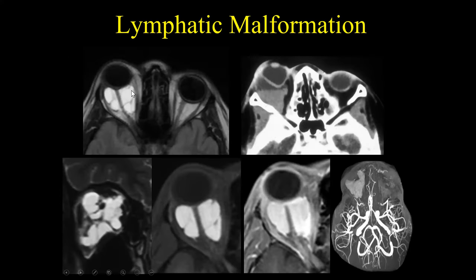Another cause of proptosis is lymphatic malformation. Here we can see high T2 signal with multiple small septations. Lymphatic malformations can occasionally have small vessels — lymphatic capillary malformations — and if they bleed, they can result in acute proptosis. We can see a blood-fluid level and distortion of the globe, sometimes referred to as a tension globe. These patients typically present with acute onset of proptosis.